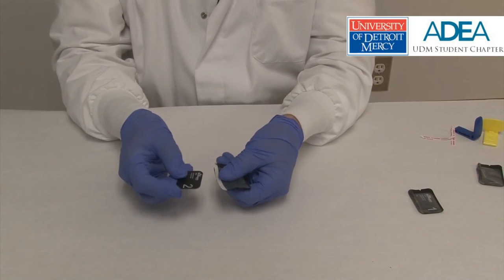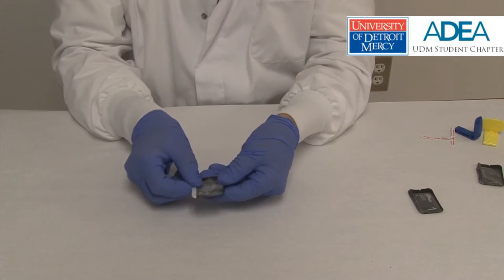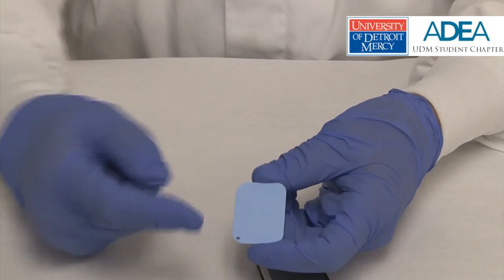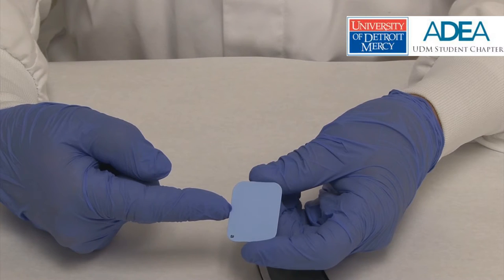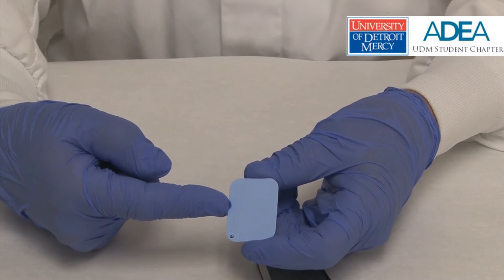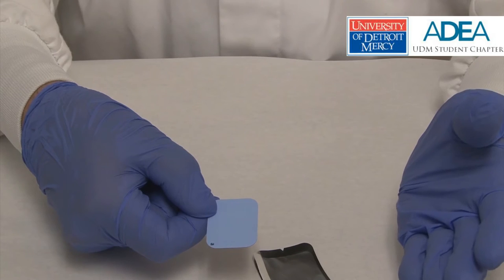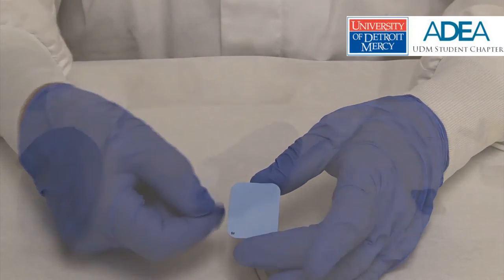You will notice that the image side of the sensor is placed face down in the protective sleeve. Why is that? The image side, the blue side of the sensor, is sensitive to the full spectrum of electromagnetic radiation. For diagnostic purposes, we use X radiation. Outside on a sunny day is ultraviolet radiation. Room light or fluorescent lights in the clinic give off a spectrum of electromagnetic radiation.